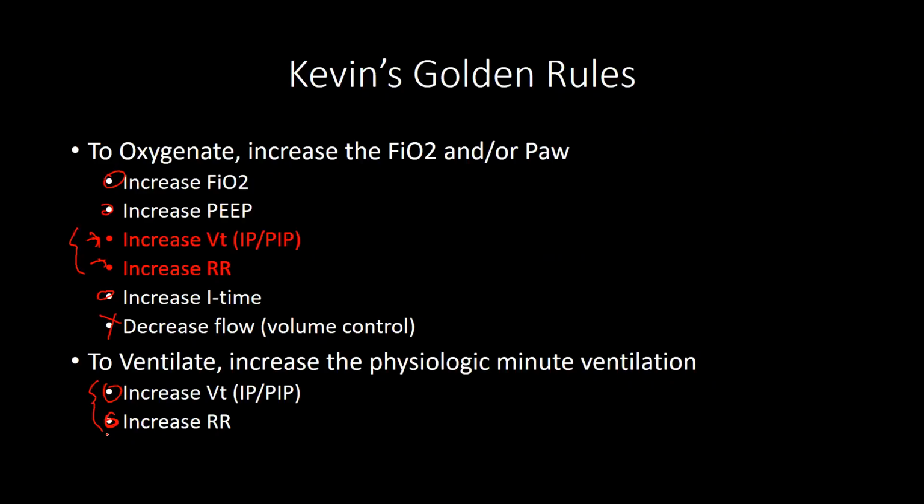Both problems in what? I'm sorry, I missed that. So you'll notice that to oxygenate better and to ventilate better, both of those things that are in red on the oxygenation side are the same as what is down here with ventilate. And so they share that in common. So if you need to oxygenate better and ventilate better, you're going to want to pick one of those two that are in red, because that affects both oxygenation and ventilation. Gotcha. Okay? Yes, that is on the test.